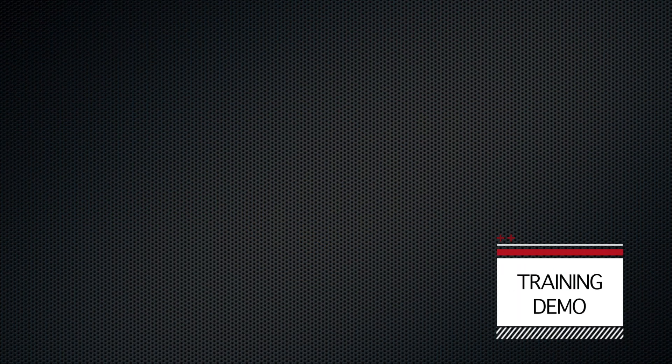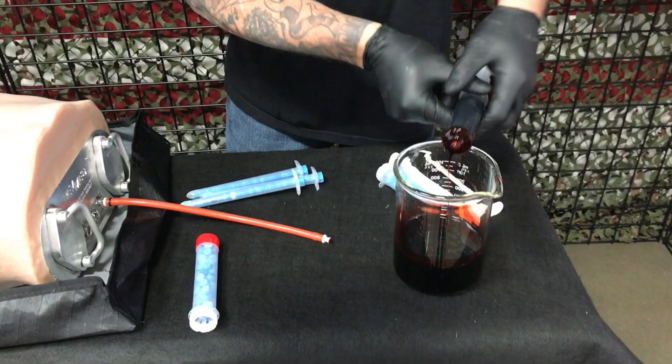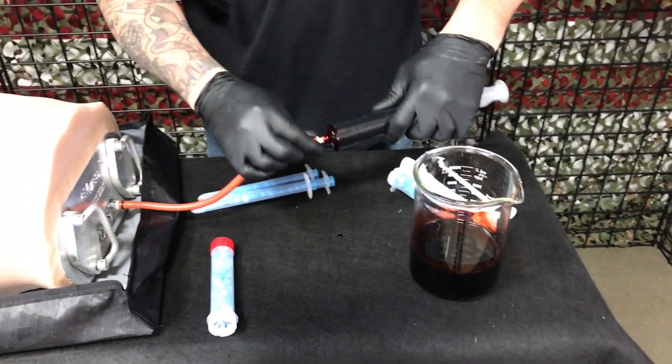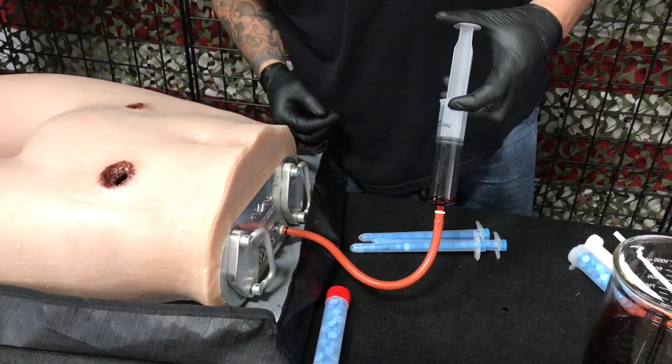Now let's go through a simulation from start to finish. Make sure the cylinders are in the closed position prior to starting your simulation. Connect your fluid source. Here, I'm using a 60cc syringe with some simulated blood. You must first push all the air out of the line before you begin to see bleeding in the wound.